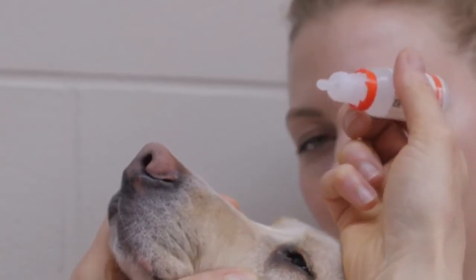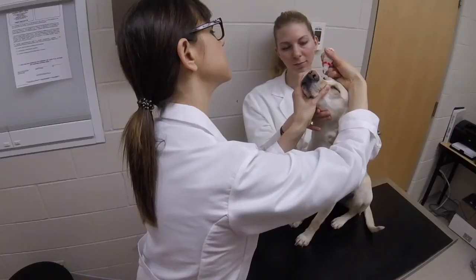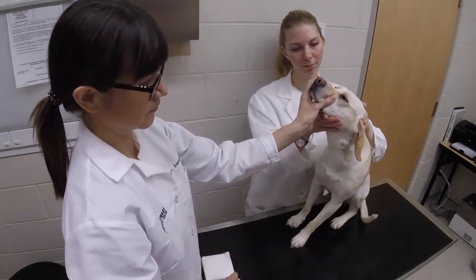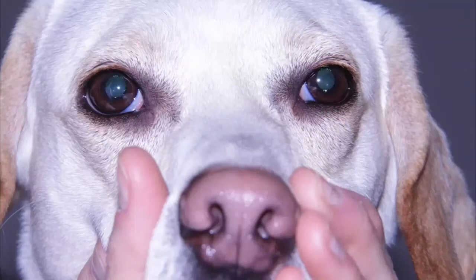One drop of mydriatic is placed on the cornea of each eye, and after approximately 20 minutes, the pupils should be sufficiently dilated for intraocular examination. While awaiting mydriasis to occur, the orbit, adnexa, and anterior segment can be evaluated.